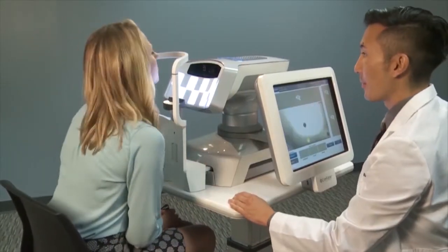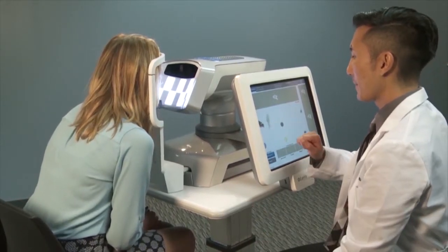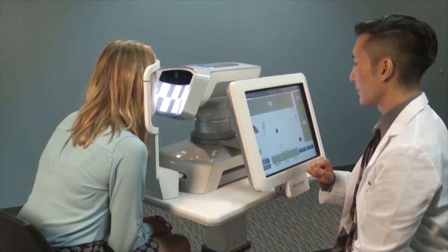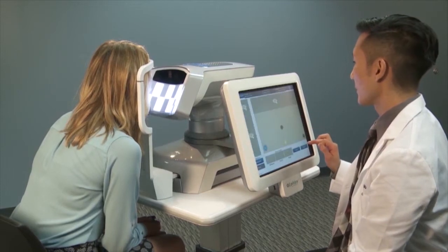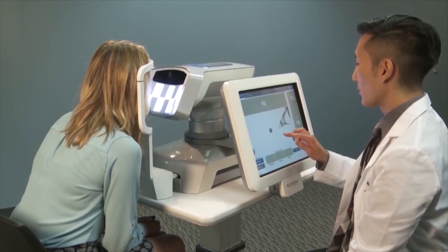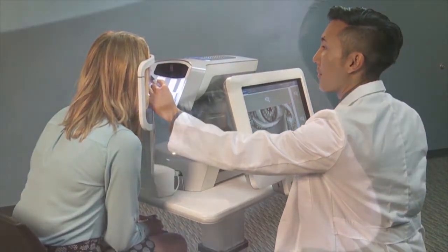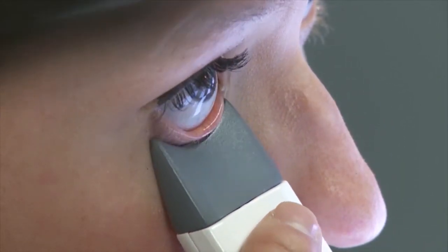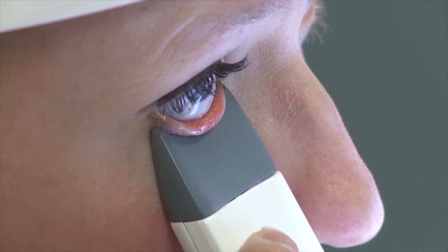Position the patient properly into the chin and forehead rest. Once the patient is positioned properly, select the right or left upper or lower eyelid by touching the Magnify View icon in the applicable quadrant on the gland image capture screen. To image the lower eyelid, place the lid everter on or slightly below the lashes. While maintaining contact, pull the lid down and then roll the lid everter slightly inward and upward.